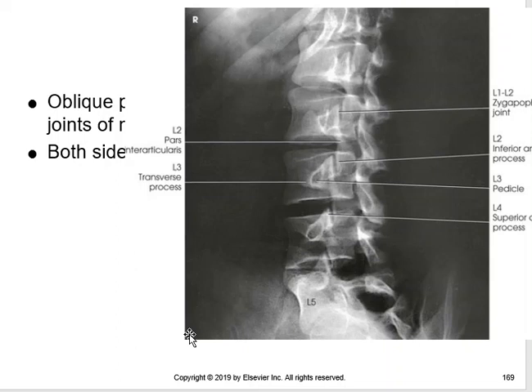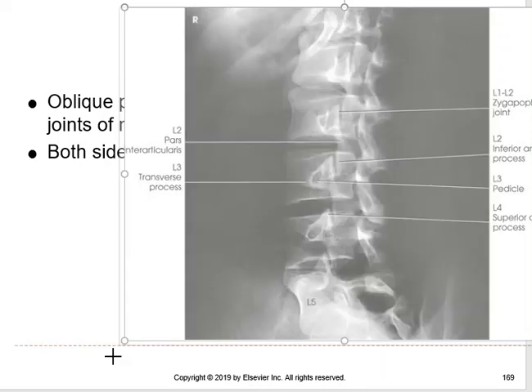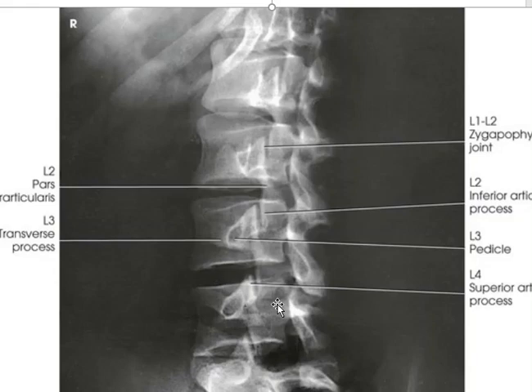This electronic image is just not real good for showing exactly what I want to show you, but it looks like it comes to right about there. And that's about where you want your transverse process to be, right at the edge of the vertebra. This one's a little bit further back into the patient, which indicates that if that was the vertebra that we were looking for, we're probably a little bit over oblique.